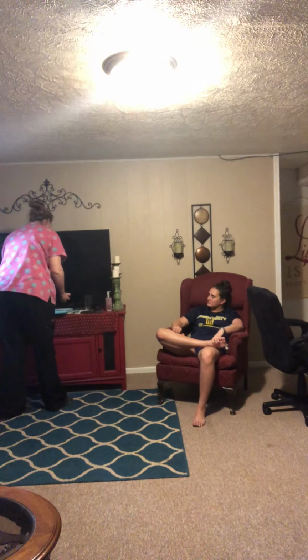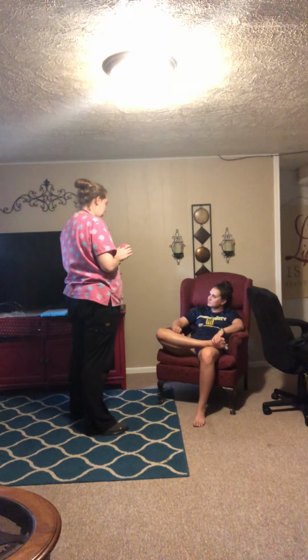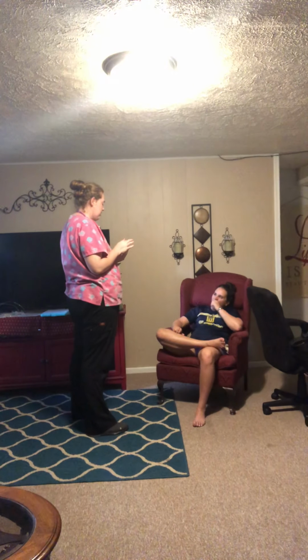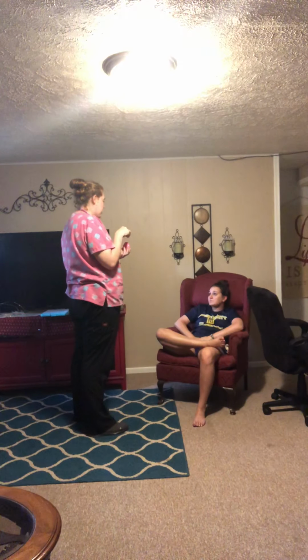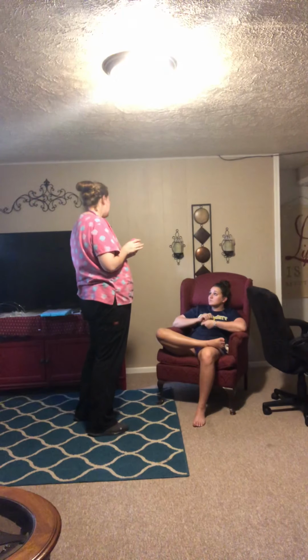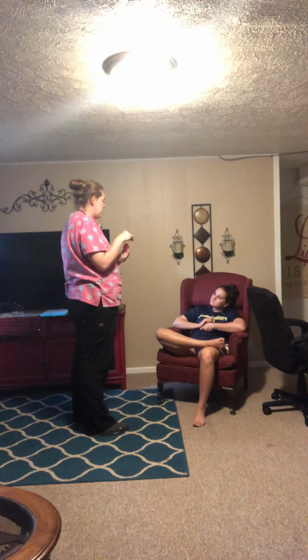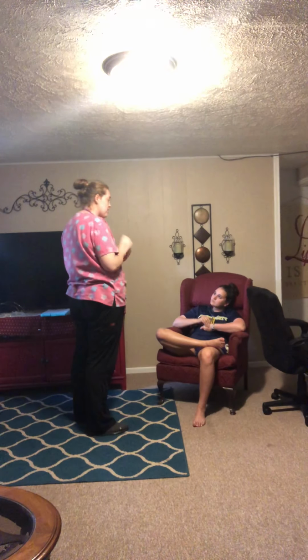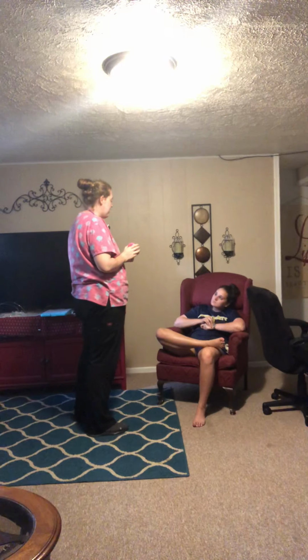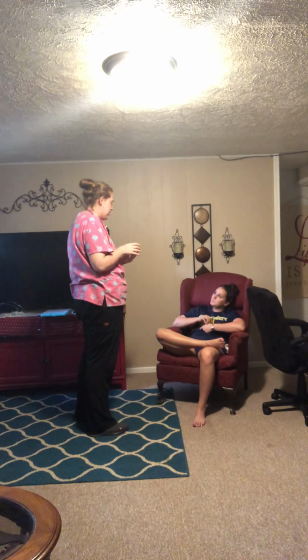Alright, very good. Okay, so the next treatment that we're going to take today is the aclidinium bromide, which is a dry powder inhaler. We're going to take this once daily. And to use a dry powder inhaler, you will open the protective covering here, and you're going to wrap your lips firmly around the mouthpiece. Before you do so, you need to turn your head to the side and take a really deep breath out, as far out as you can. When you're ready to breathe in, you'll wrap your lips around the mouthpiece, take that deep breath in, hold it for about 10 seconds or as long as you can, and then when you exhale, you'll exhale to the side as well. That way we're not clumping up any of the medication inside the device.